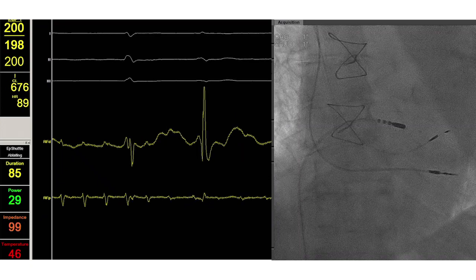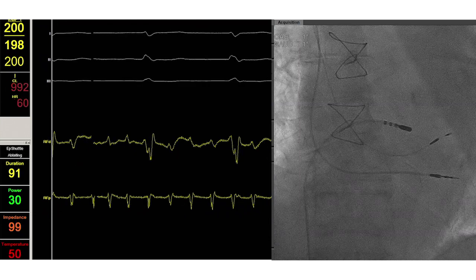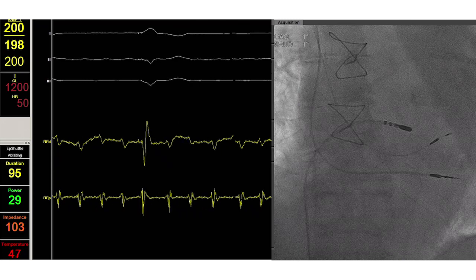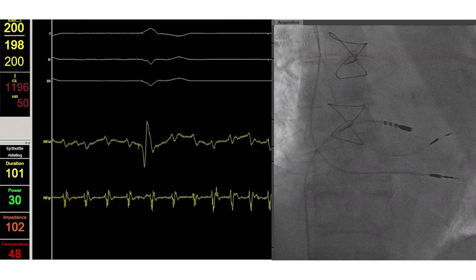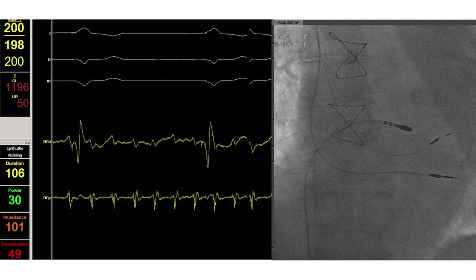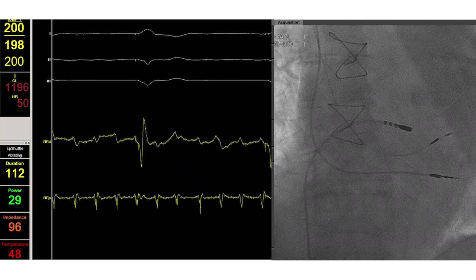Again we see slowing down of the AV conduction and appearance of paced beats, signifying ablation success. We will continue to ablate this area for a few more minutes. But we are confident to acquire complete and lasting AV block, which will greatly help this patient with the LBBAP pacemaker.